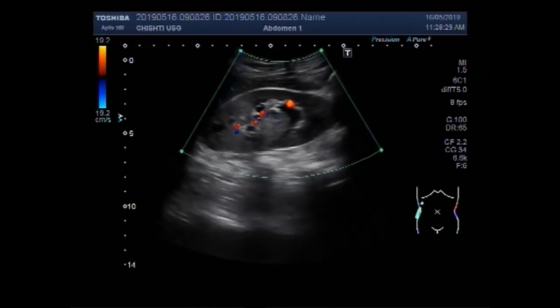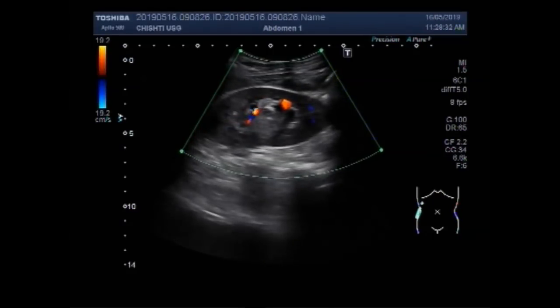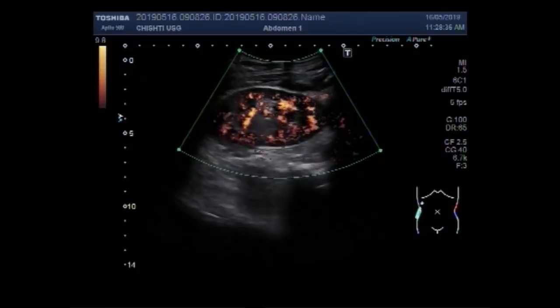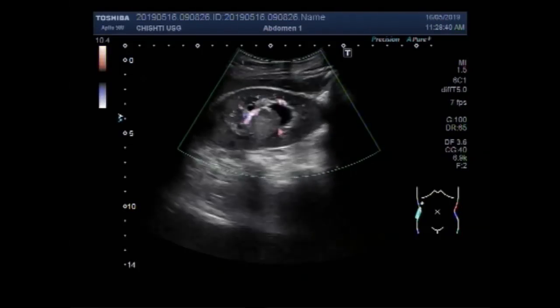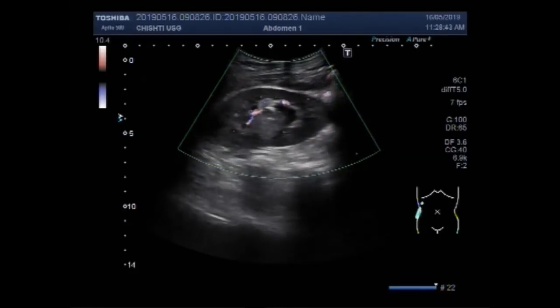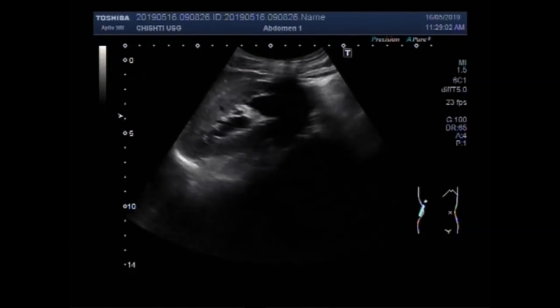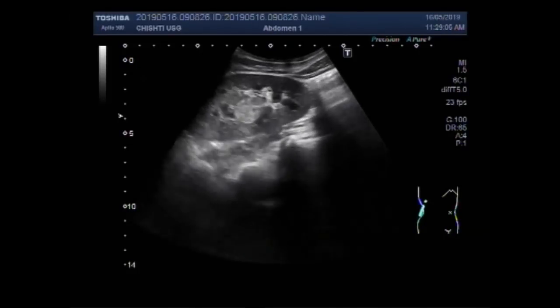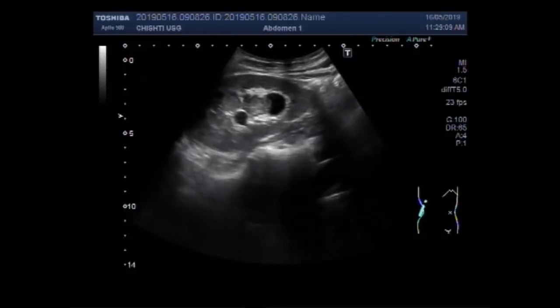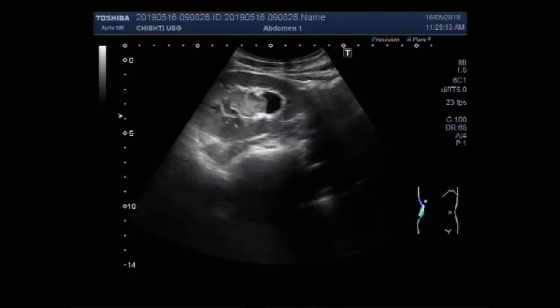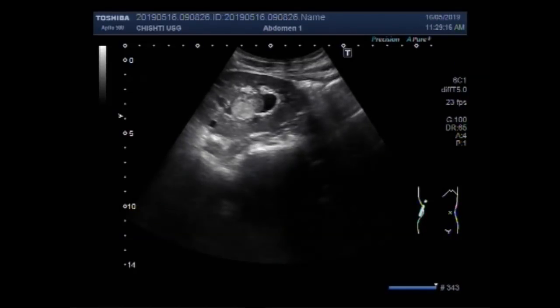Blood flow is also visible, especially in the rim region of the mass. Now we change the position of the patient to the lateral decubitus position, and you will see the mass in the central portion of the kidney. This mass is also round to oval in shape but has homogeneous echogenicity.